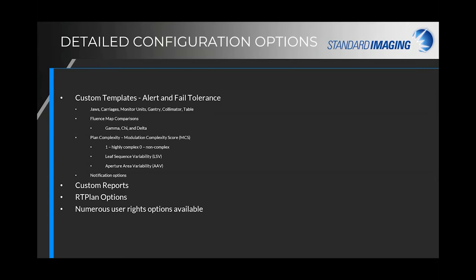When you first acquire LinacView and after it's set up and installed, the administrator for your system will need to spend some time going through and reviewing all of the setup options, of which there are numerous ones. You can begin with the default, but everything is customizable, and individuals like that quite a bit.